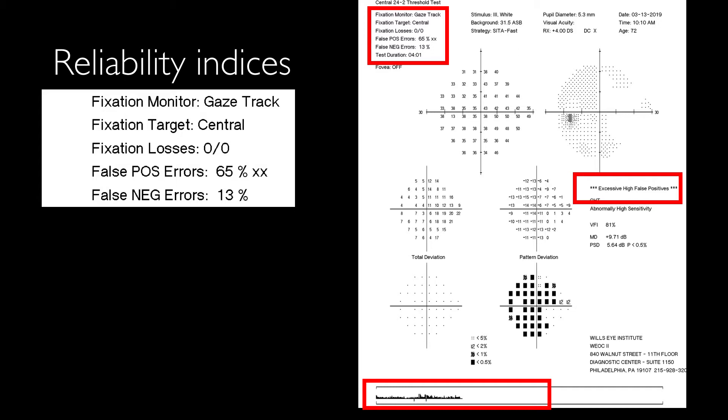Right below the gray scale we have a message which is some sort of interpretation of the reliability indices that we have at the top box, and at the bottom part of the visual field test we have the gaze graph.